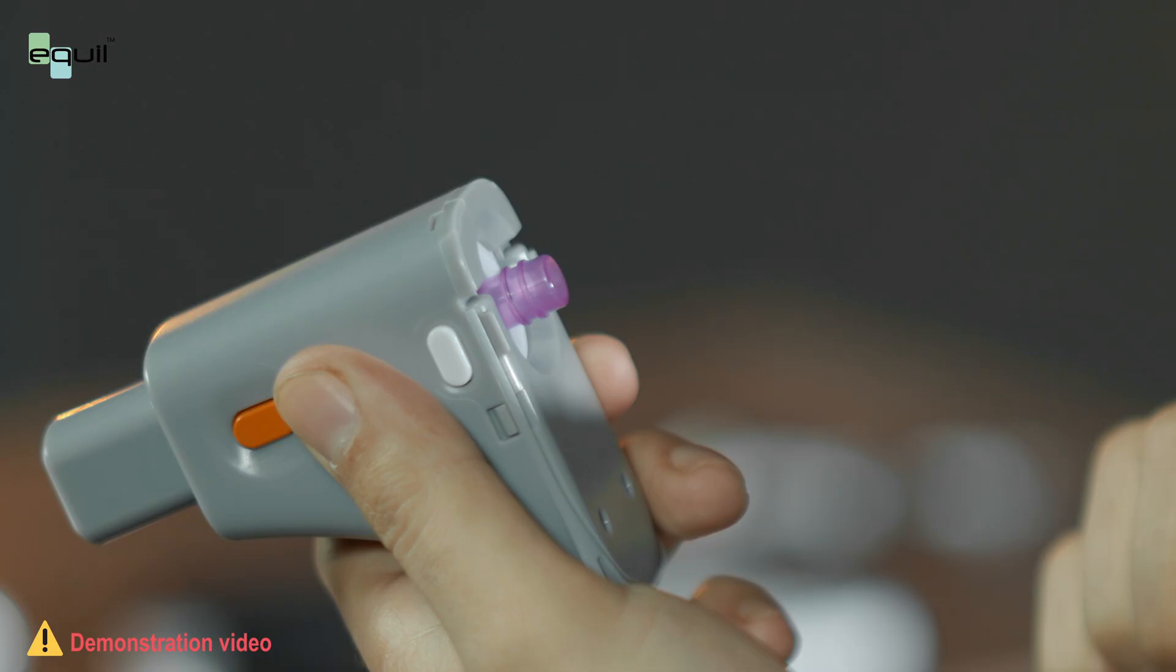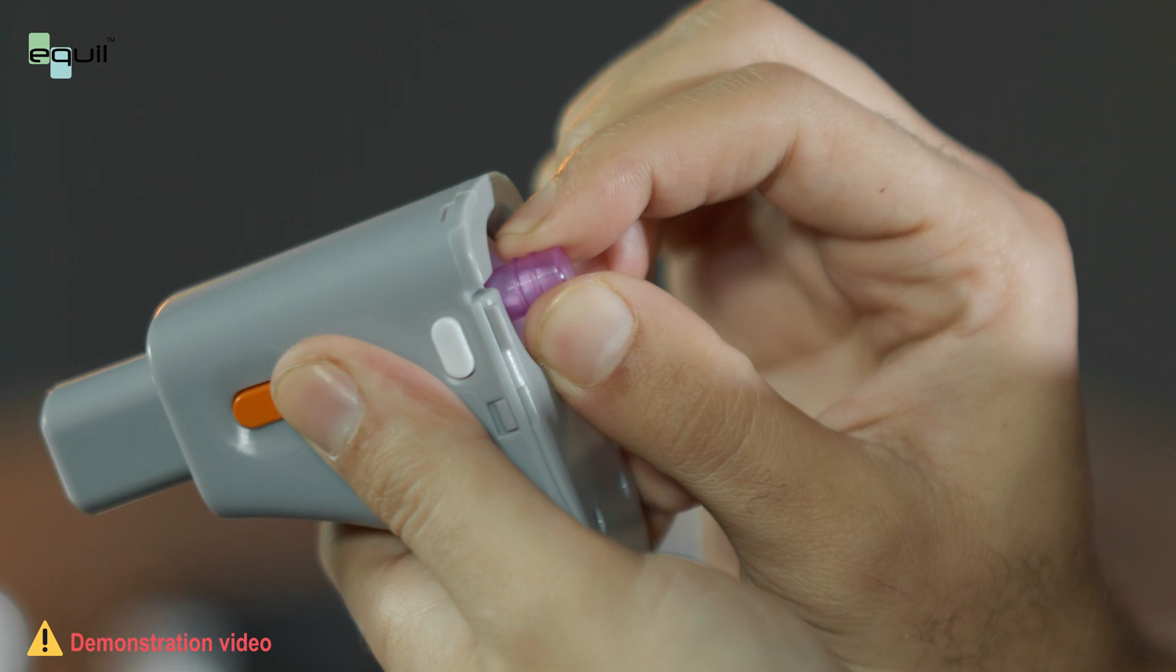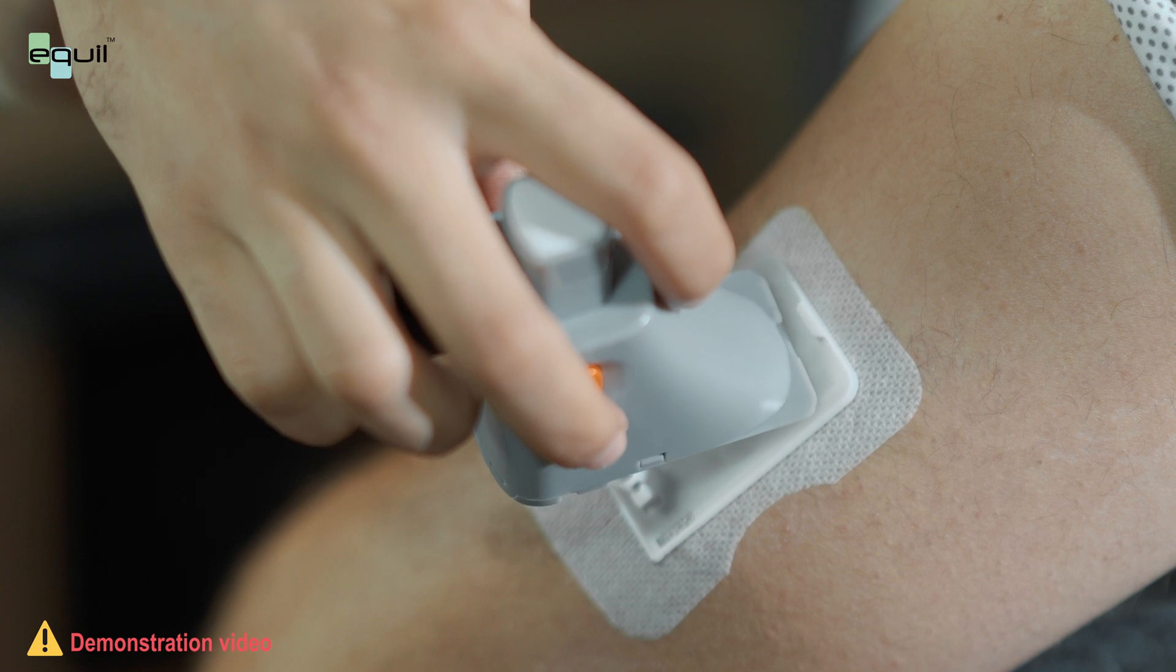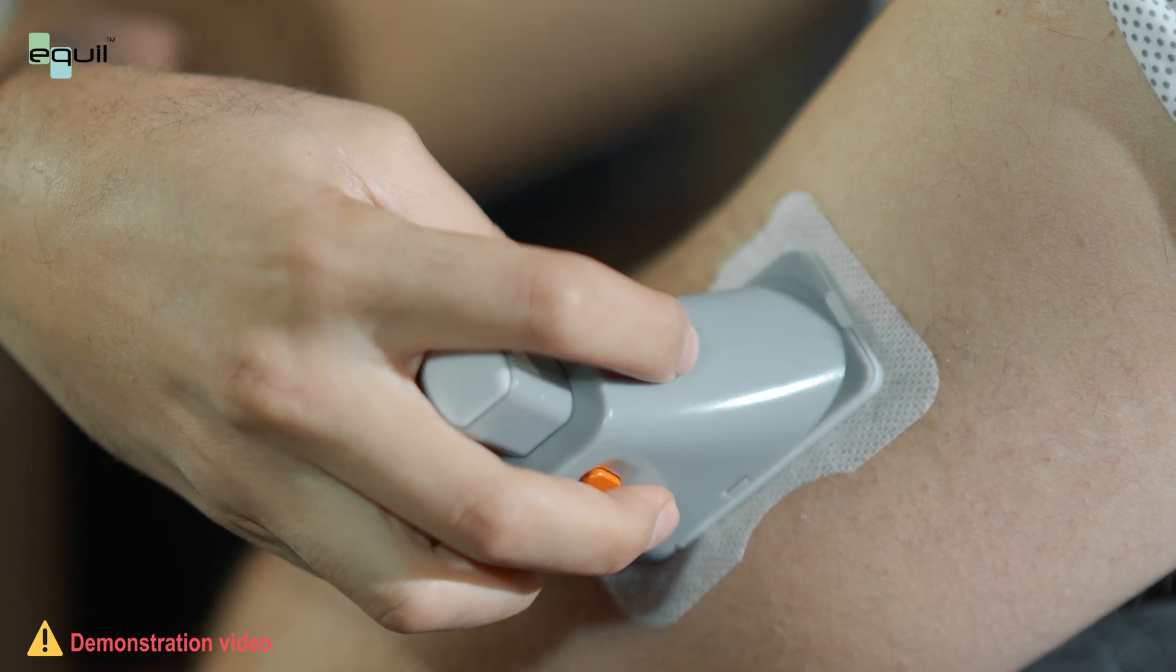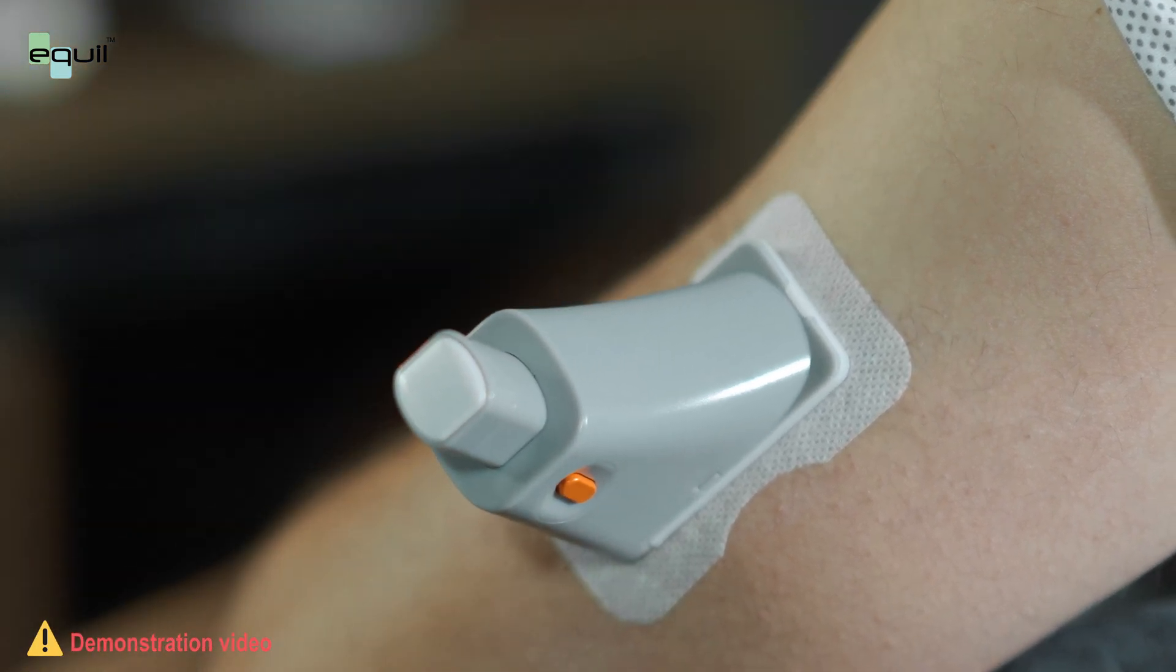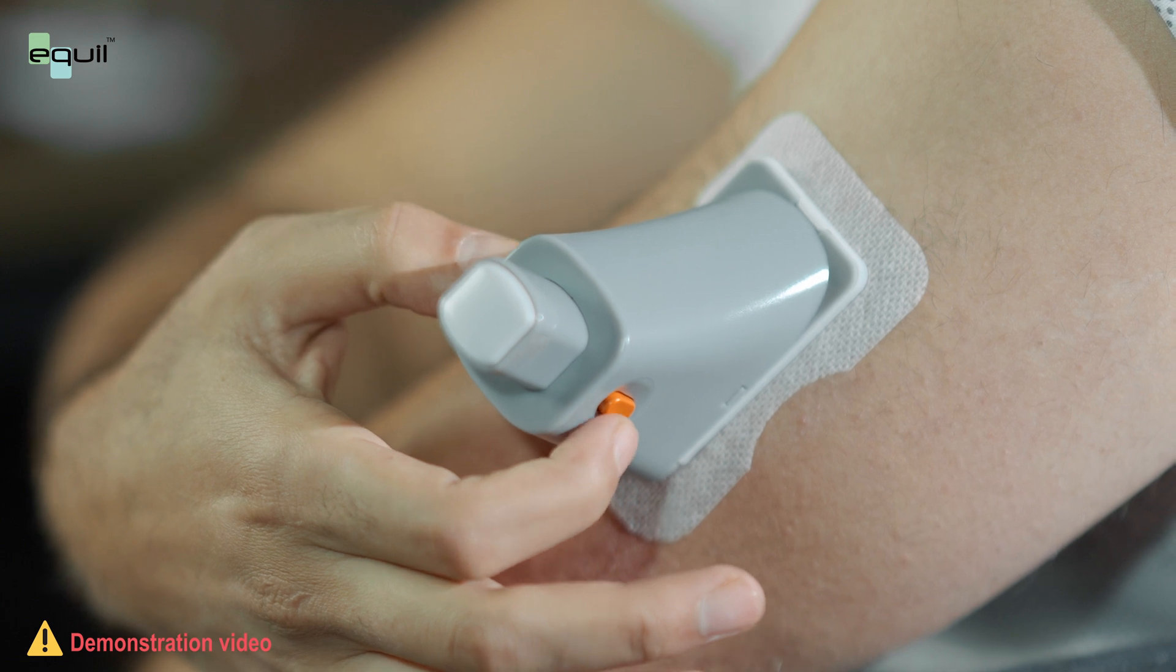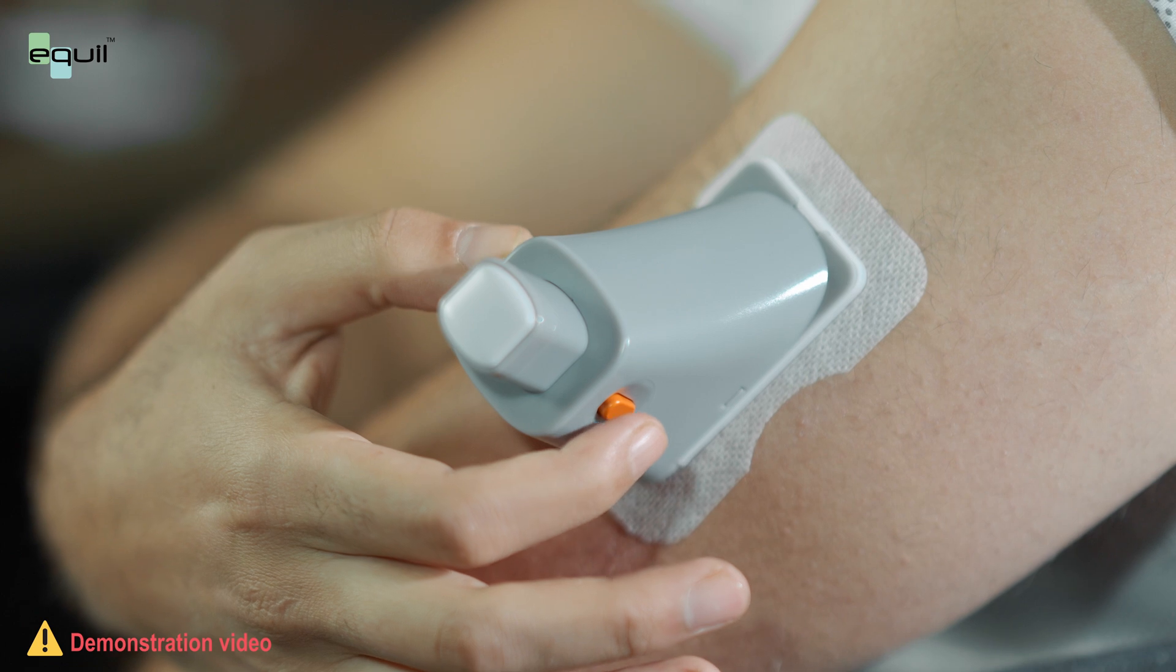When we are certain that the inserter is held firmly in the cock position, we can now remove the protective sleeve. Hold the canula inserter and align the front end with the bottom of the protruding part of the pump base as you can see. Press on the back of the canula inserter until we hear a click securing it in place. Now we can simply install the canula in the injection site by pushing the two orange release buttons on both sides of the canula inserter at the same time.